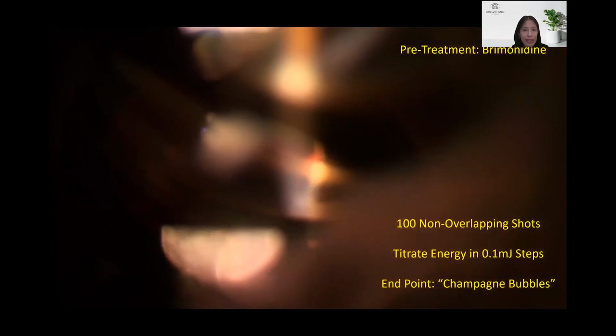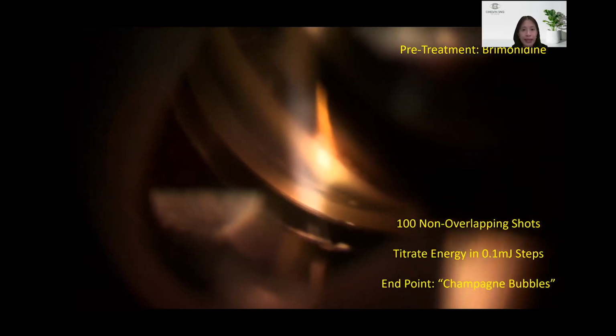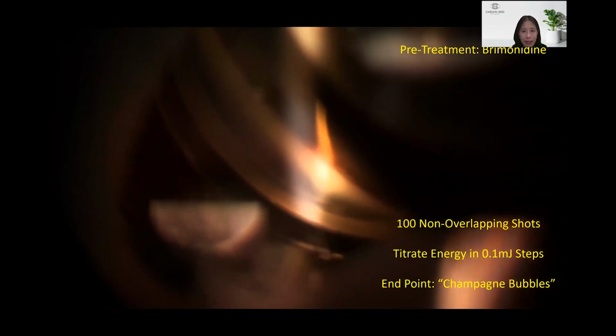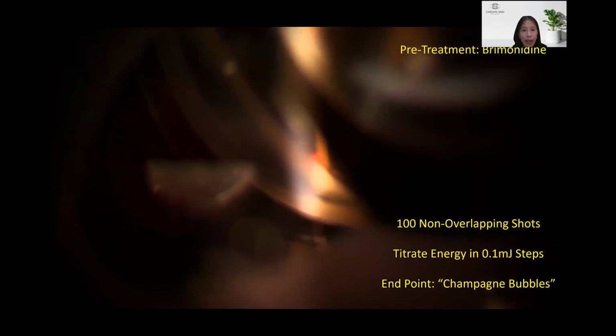This video shows SLT performed with the NIDEK YC200S+, which I have in my clinic. You can see that the view with the laser machine is very good as it has a high-quality optical system with LED illumination. The aiming beam is also precise with a sharp edge, so it is easy to focus.